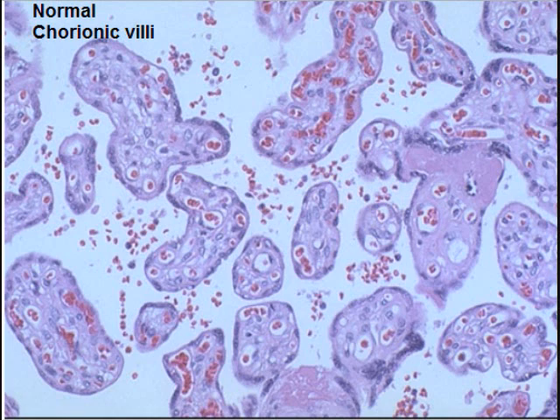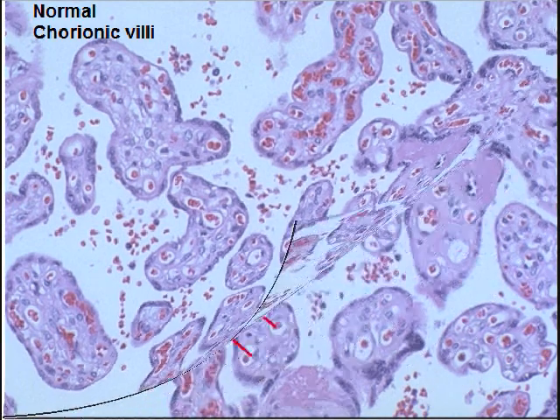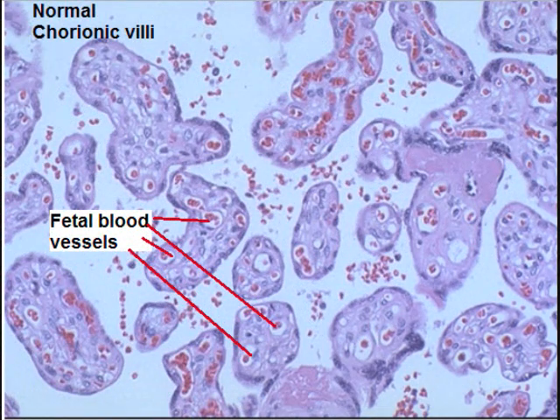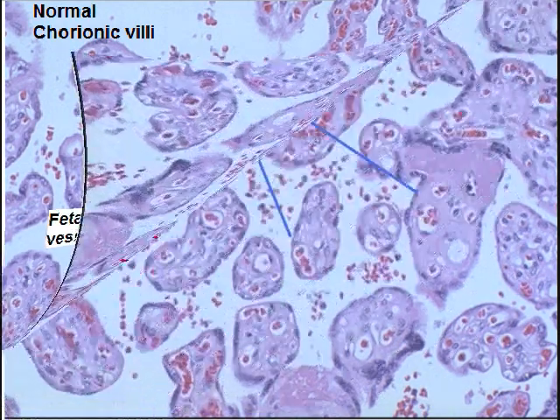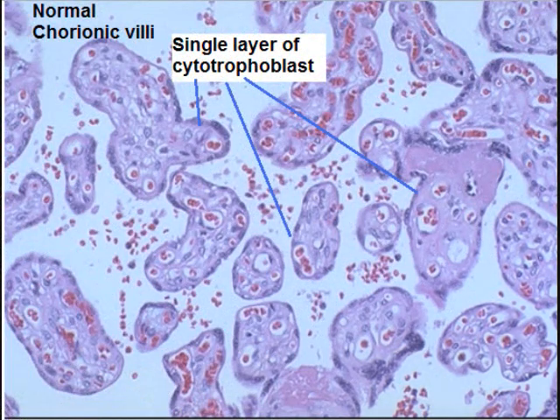For comparison, normal chorionic villi have fetal blood vessels inside the villi and there is no hydropic change — no swelling. You can appreciate there is a single layer of trophoblastic tissue, the cytotrophoblast, and there is no trophoblastic proliferation in normal placental tissue.